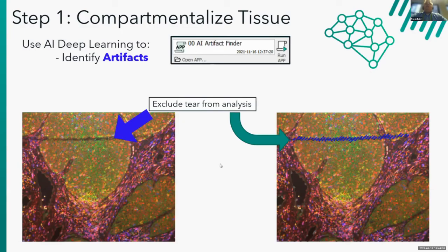What we're going to do in Visiopharm in Oncotopix Discovery is create an analysis pipeline. In the first stage of the pipeline, we want to find any artifacts. The way this is done is by grabbing many, many images that might have the different types of artifacts we're looking for, and we're going to train the computer to learn what these artifacts are and what is good tissue. That may be different between looking at cancer patients versus looking at plants of different species and different imaging modalities.